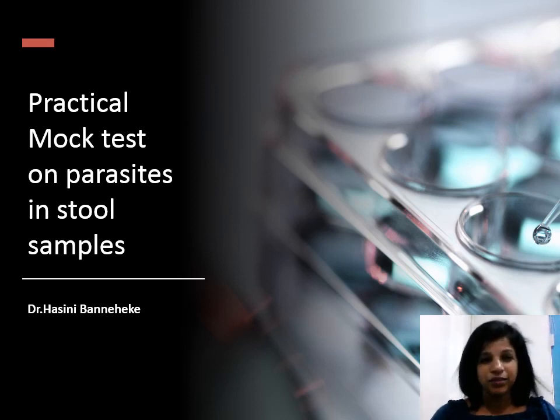Welcome, and today we are going to do a mock test. This is rather a practical test for you to identify parasites in stool samples. So I will be showing you certain structures which are the parasites, mostly in stool samples. Some may have little deviations from time to time as well, but mostly I'm concentrating on parasites which are present in stool samples in this presentation.